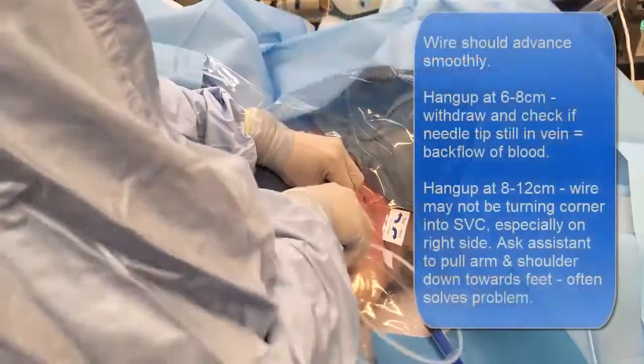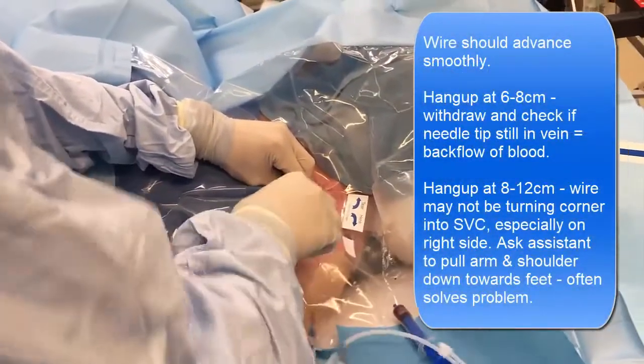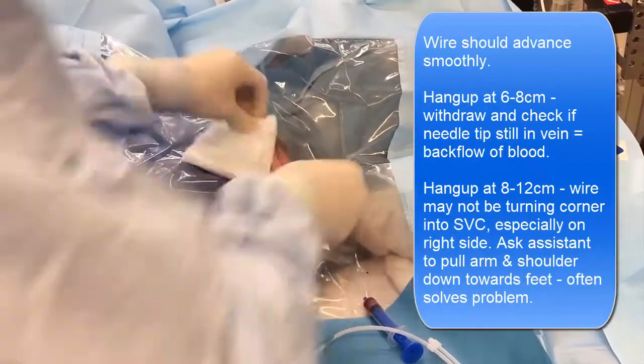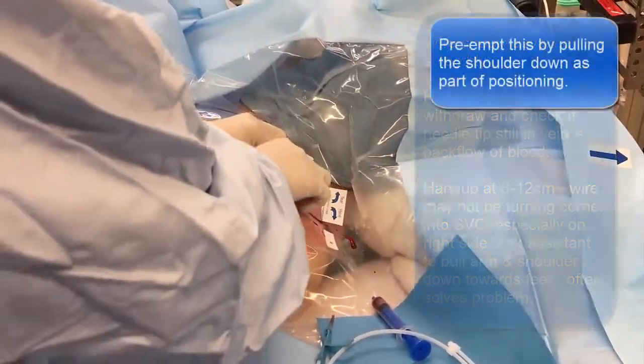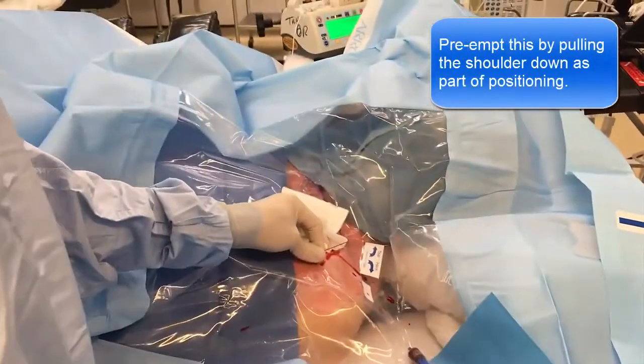Now the one thing that sometimes happens, especially on the right side, is that the wire won't feed — in which case a good maneuver is to get an assistant to pull the shoulder down. And I actually pulled the shoulder down beforehand.